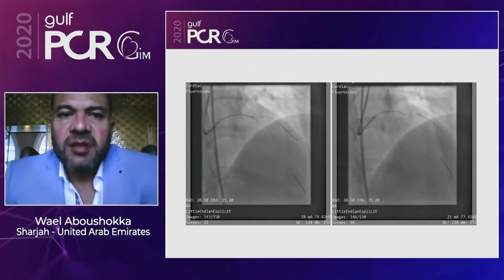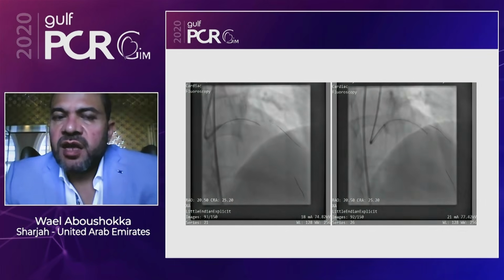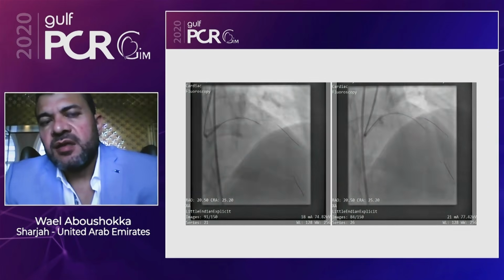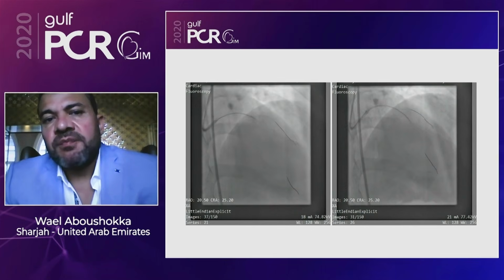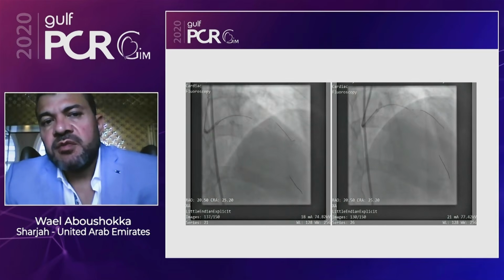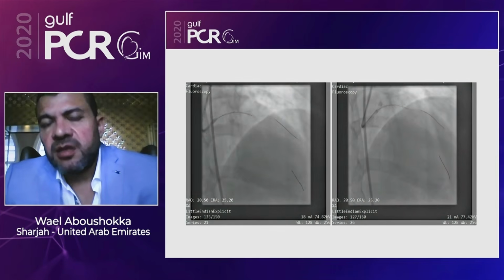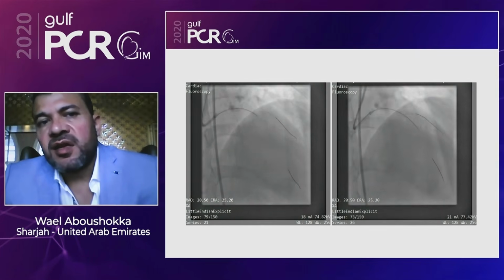The most important tips and tricks here. First, as you are using a microcatheter in the side branch, it's recommended to only use the lower speed, the 80,000 RPM. The other thing, during the rest between runs of atherectomy, it's better to change the side of your microcatheter, either by pushing it forward a little bit or pulling it back to change the area where it contacts the atherectomy device.